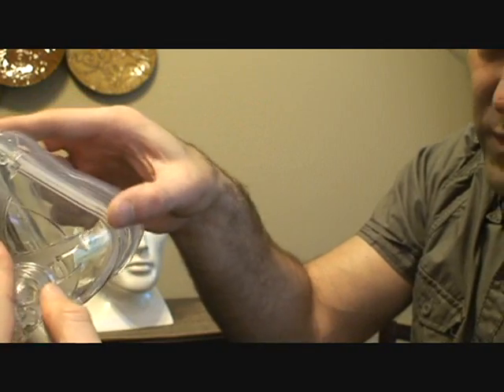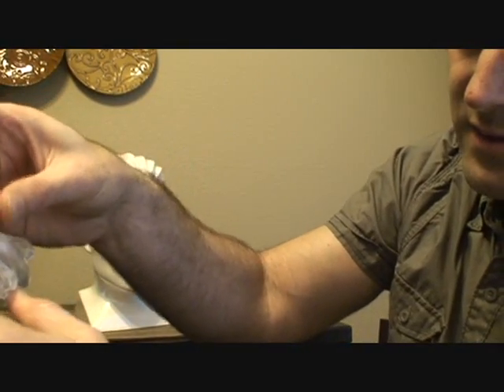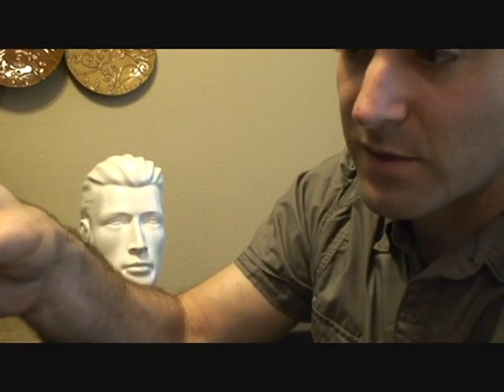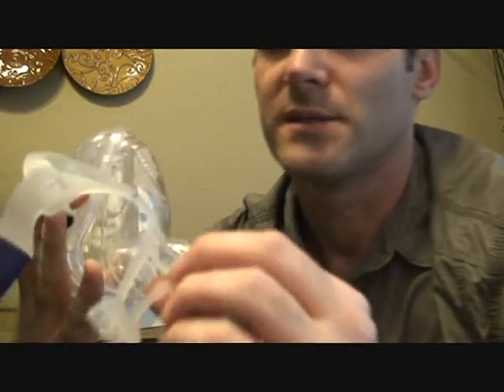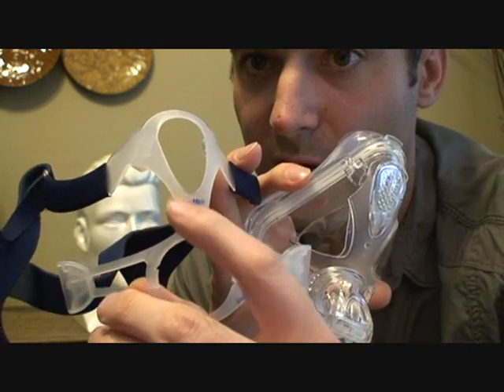Be methodical about it — push it in all the way around the mask and you'll find that it lines up really well with all the other notches that are supposed to hold it. Once that's done, you can see it says 'ResMed' right there, so you know that side is facing up the proper way.